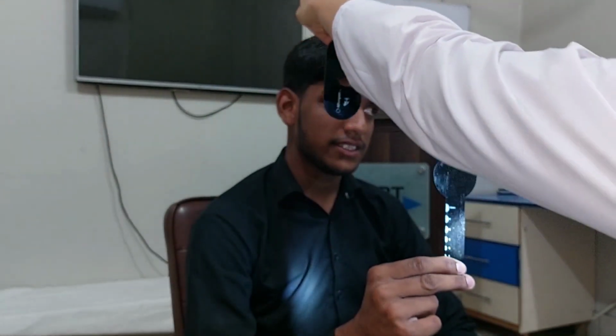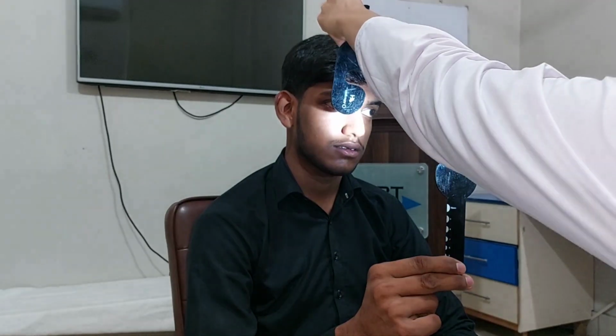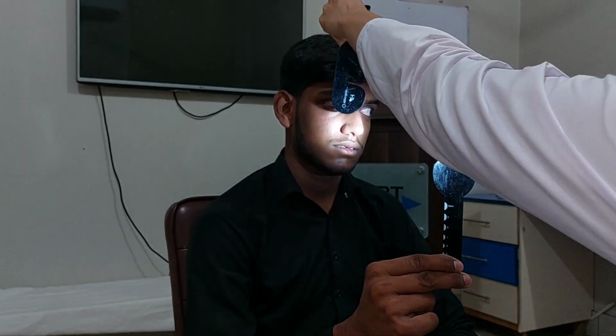I am covering the fixating eye and observing the other eye.